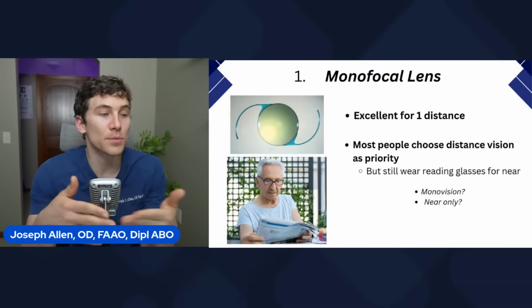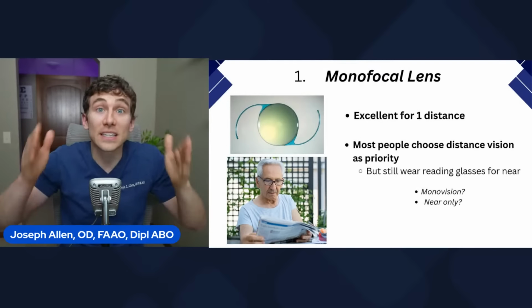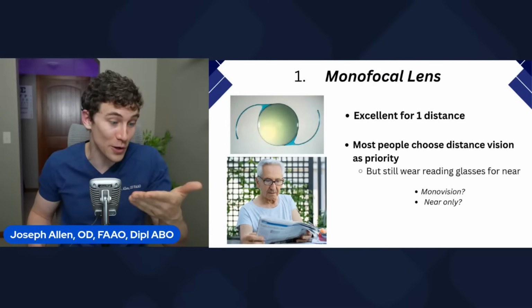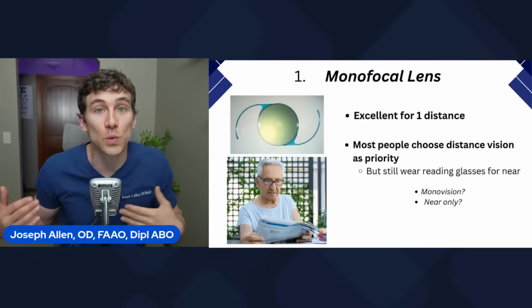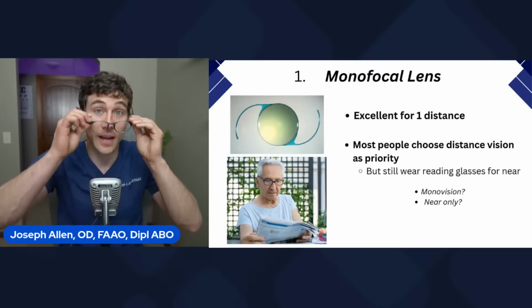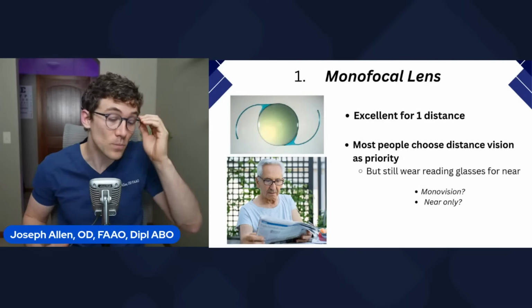So if this was the option you would go with, you would, at the end of the procedure, hopefully see amazing in the distance. The downside is that you're unable to use your eye muscles to focus on things up close. And so oftentimes these individuals rely on reading glasses whenever they have to, again, read a book, look at their phone, or anything like that. So they are often taking their glasses on and off throughout the day.